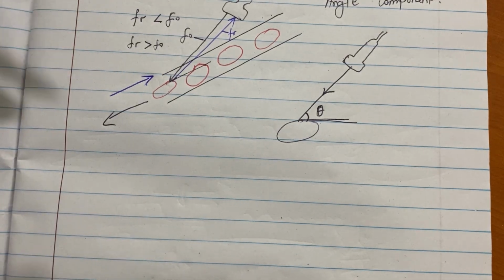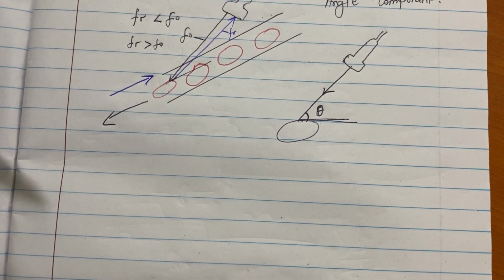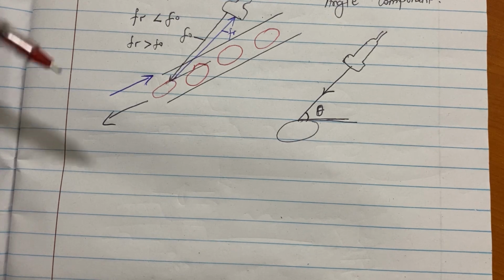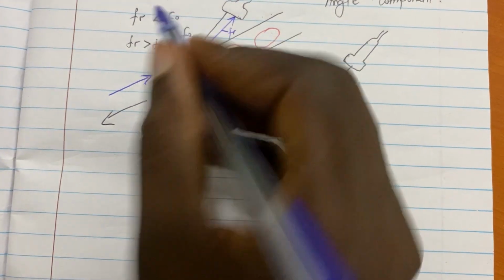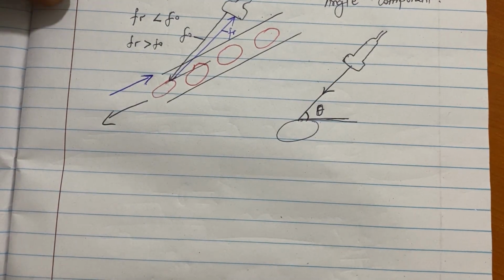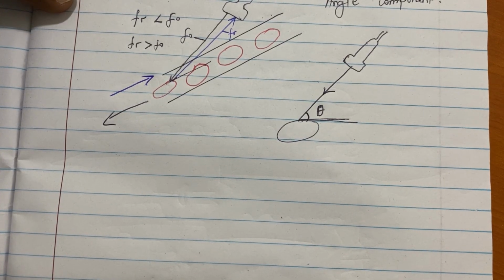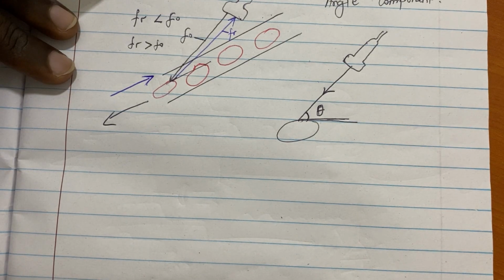I've shown you the Doppler shift. I've shown you when the reflected frequency is greater or lesser than the transmitted frequency. The transmitted frequency is the frequency from the source. I've given you what the Doppler shift is, and now I'm going to tell you more properties of sound, ultrasound.